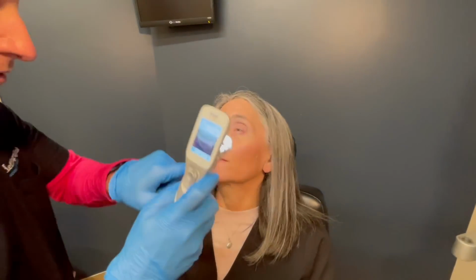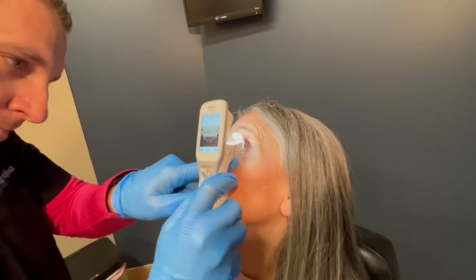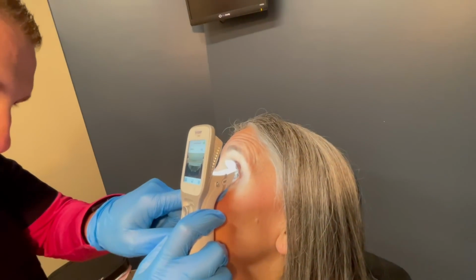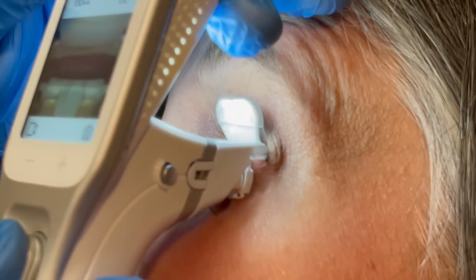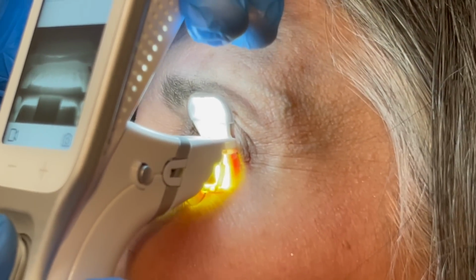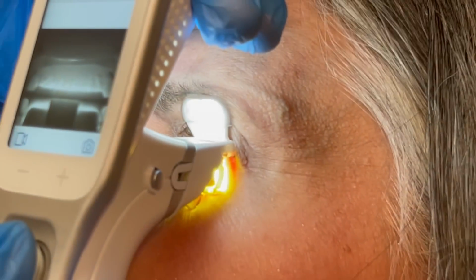This one feels so much more wet. Mm-hmm. That was the more irritated eye initially too when we were looking. Ready to keep going? Ready? Okay. Lean your head back, look up, tilt your head a little bit this way for us. Look up as high as you can go. Grab the lid, go ahead and close your eyes for us. Let's do the same thing, heating up the left lower eyelid meibomian glands.